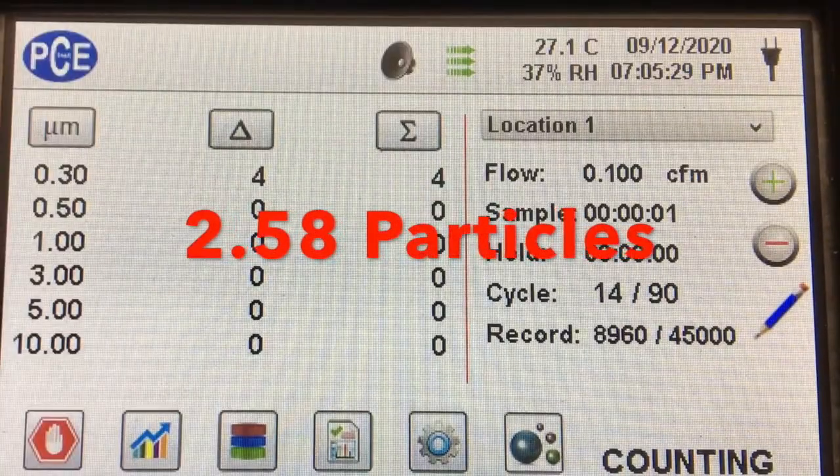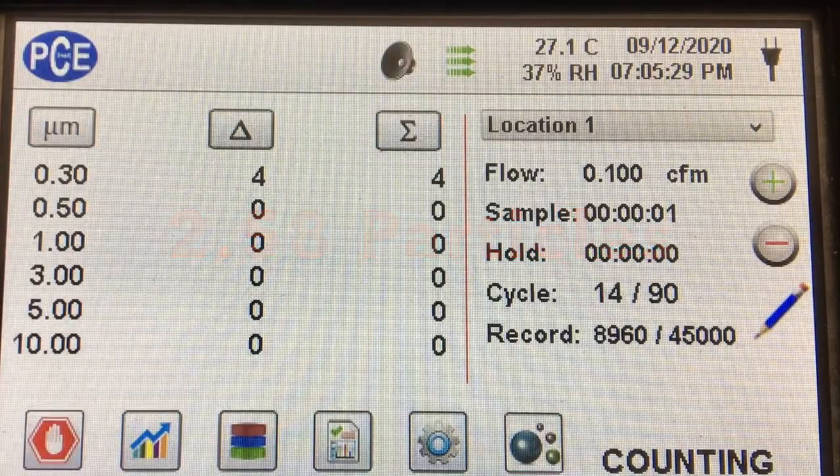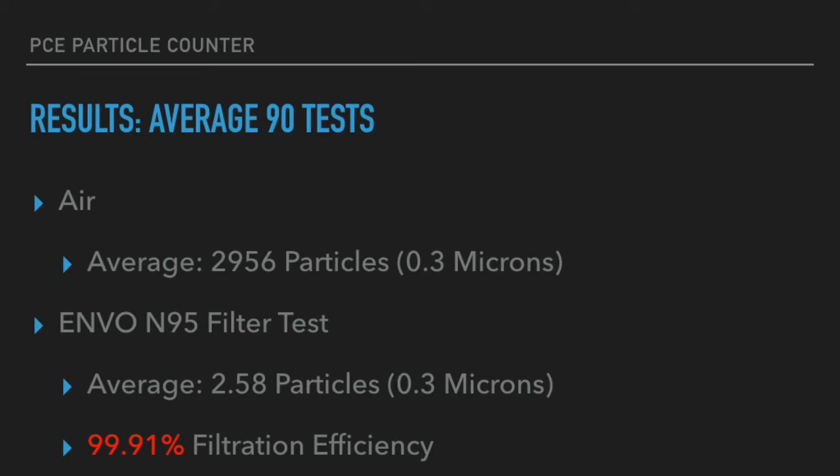We got an excellent filtration efficiency — the filtration efficiency for this filter came out to be 99.91%. This actually ended up being higher than the N95 rating that this mask is given; it should have been at 95% filtration efficiency.